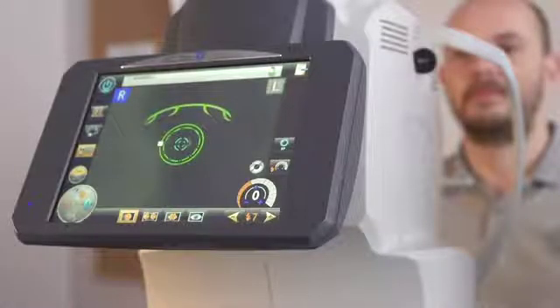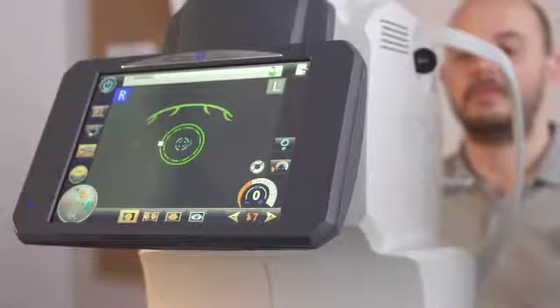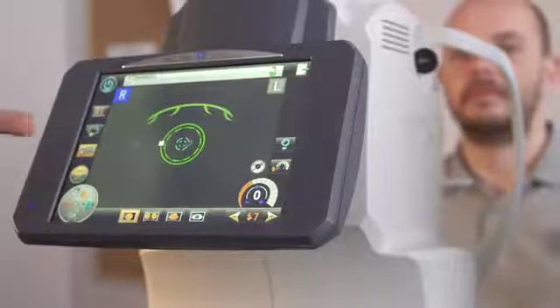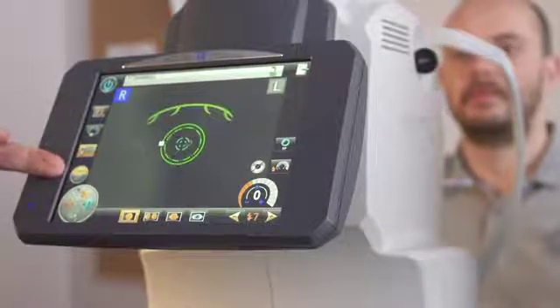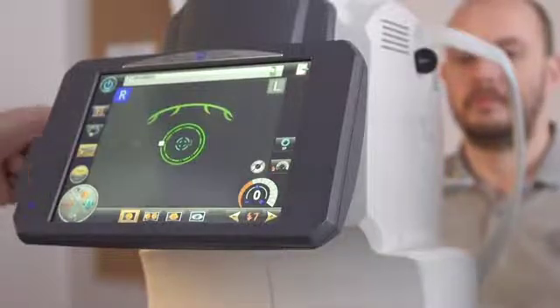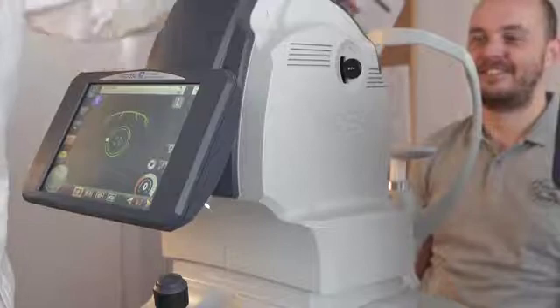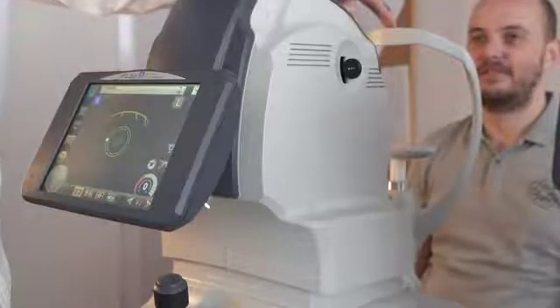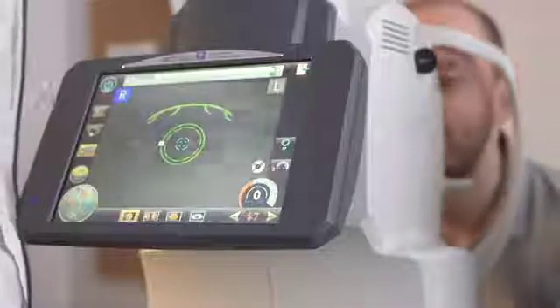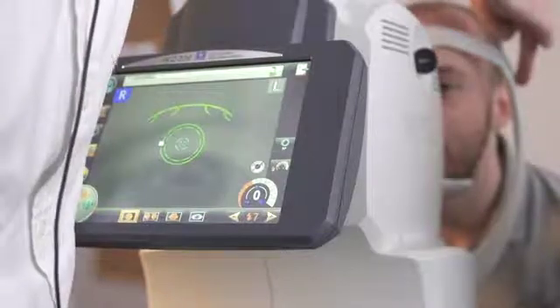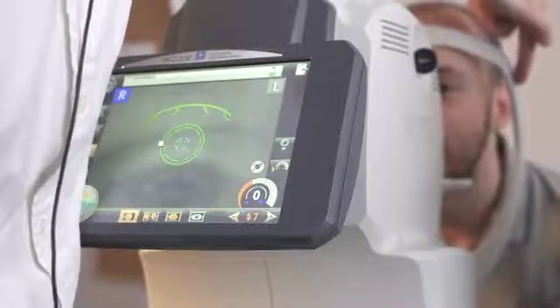So now we are all ready to take some shots of the fundus. We have the AFC330 on fully automatic mode. We just need to position the patient. They need to place their chin on the chin rest and their forehead against the forehead rest here. Their eyes should be approximately at the level of the eye indicator here.